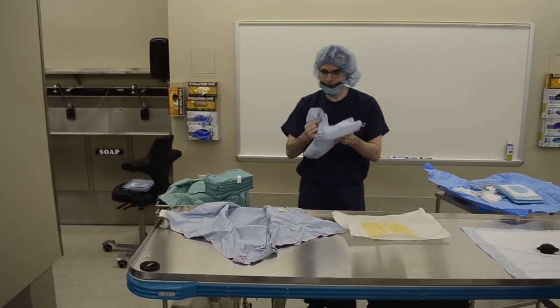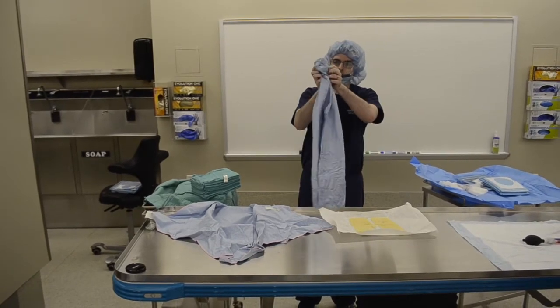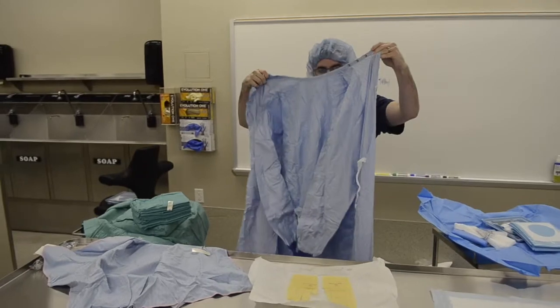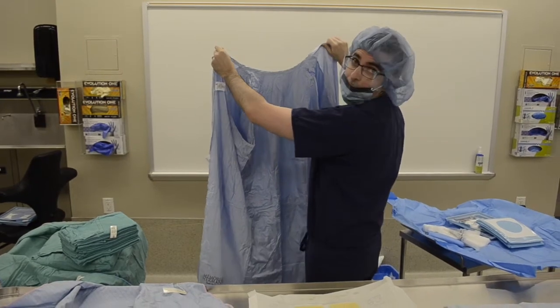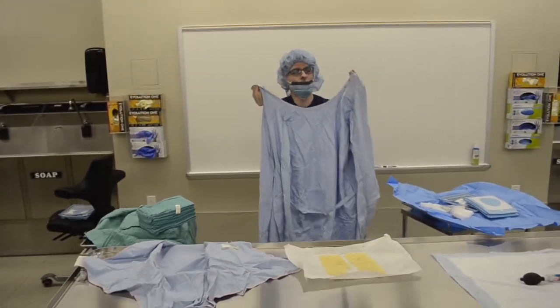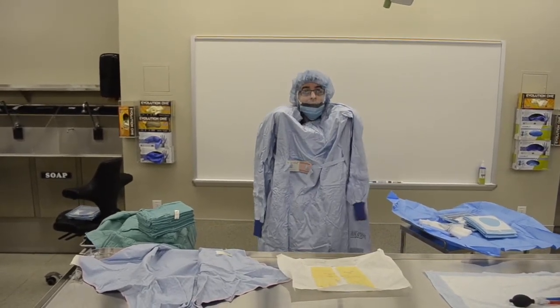So we take out our gown, find where the buttons are, you can see them up here, and then you're going to hold it this way. So I'm going to turn it around just so you guys can see too. There's a sleeve hole on both sides. That's where your arms go. Then you're going to take these 2 buttons, lift up your head, and go around the back of your neck.